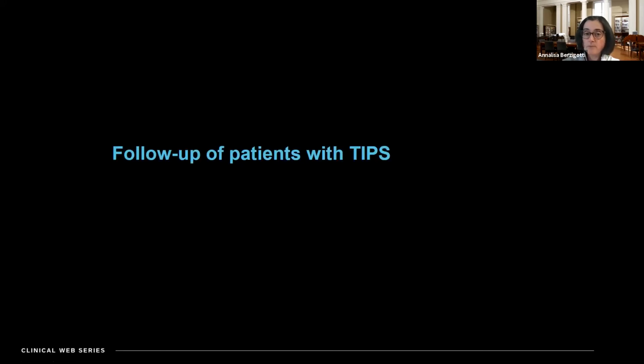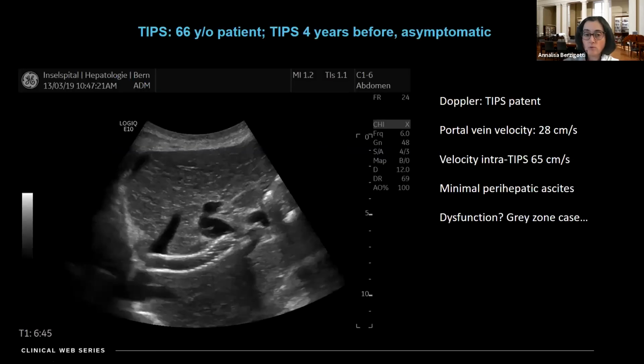And the patient stopped bleeding, fortunately. After positioning of TIPS, I think this technique could have a role. So you see here, for instance, an example of a patient who had the TIPS put in at another center. It is anatomically a bit strange, the TIPS, but still we were following him up with the standard, which is color and spectral Doppler.